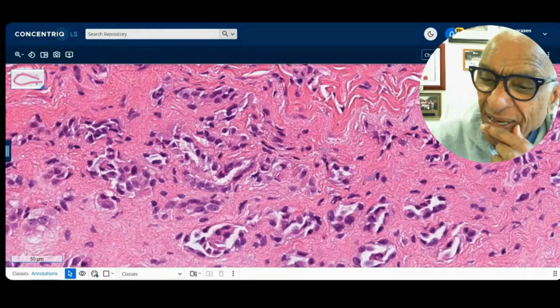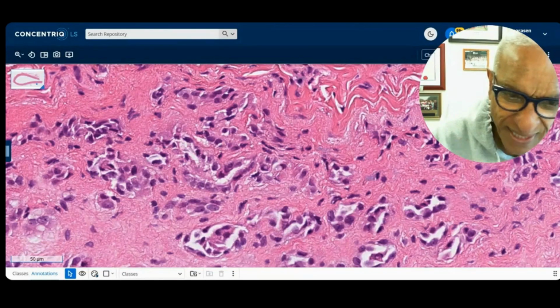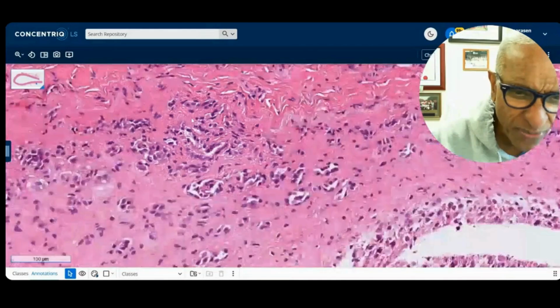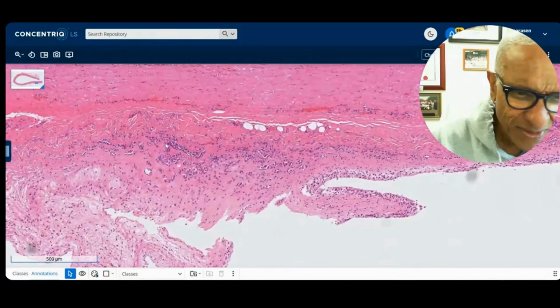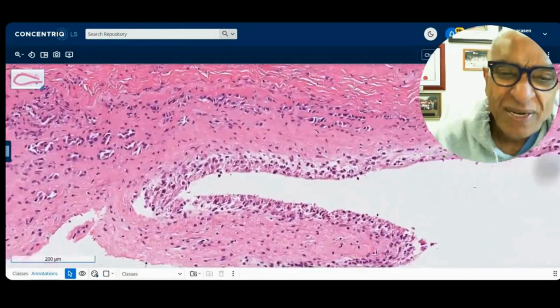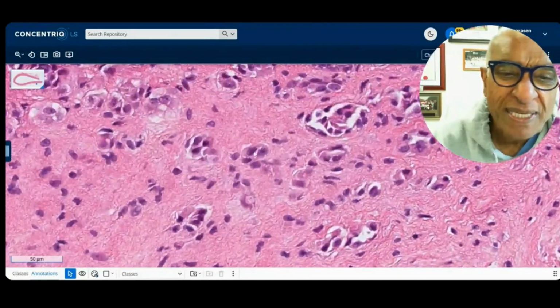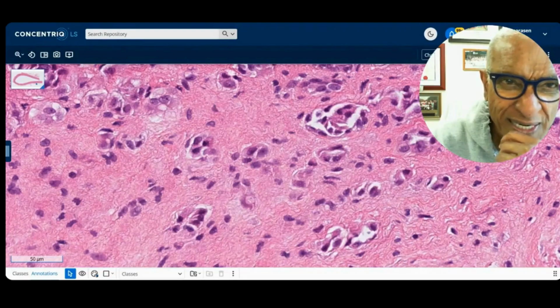Okay, so Jan, epithelioid mesothelioma, so that's giving it a neoplastic characteristic. Let me just go back to the low power of this. This is not expansive. This is just these cells hanging out in the adventitia, forming these gland-like spaces. Here, just lining the serosa, those pink larger cells, which, like I was saying, you could see them in the stroma as well. Here are these pink larger cells as well. So these have a different lineage.